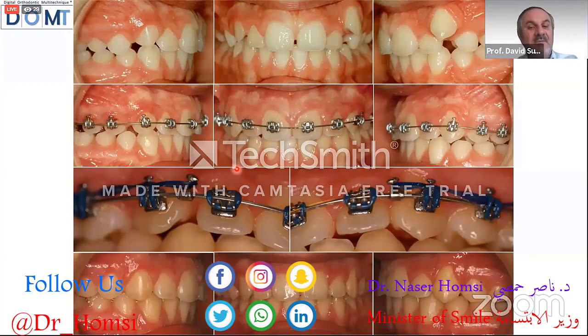What is the problem of this type of patients? We need a sliding mechanism. For a sliding mechanism, the best bracket is a passive self-ligating bracket, and the worst bracket is the conventional bracket.